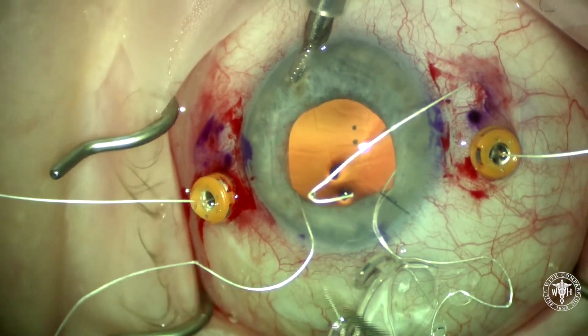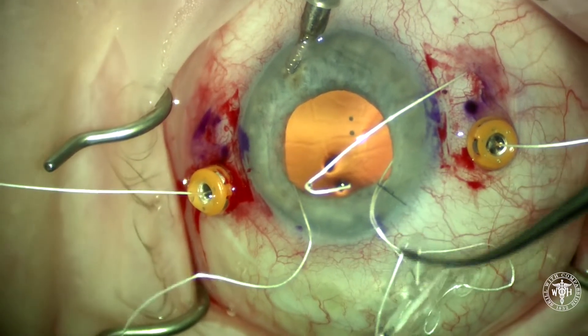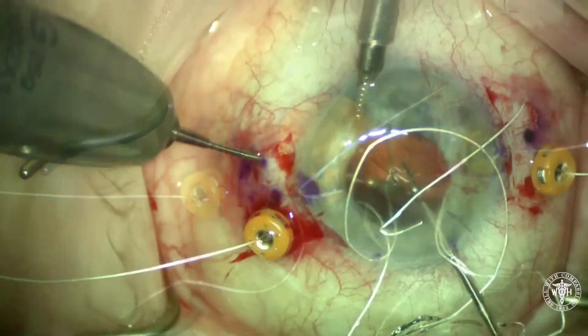Here's lacing the A060. I'm going to go down through the first haptic and then up through the second. What that's going to do is create a mattress suture.